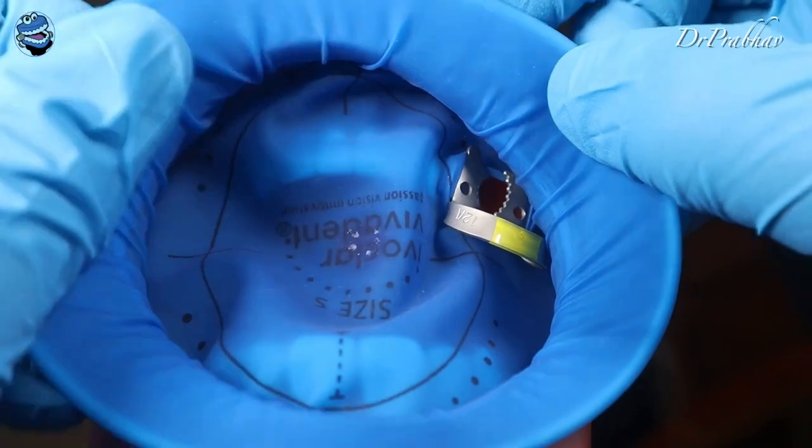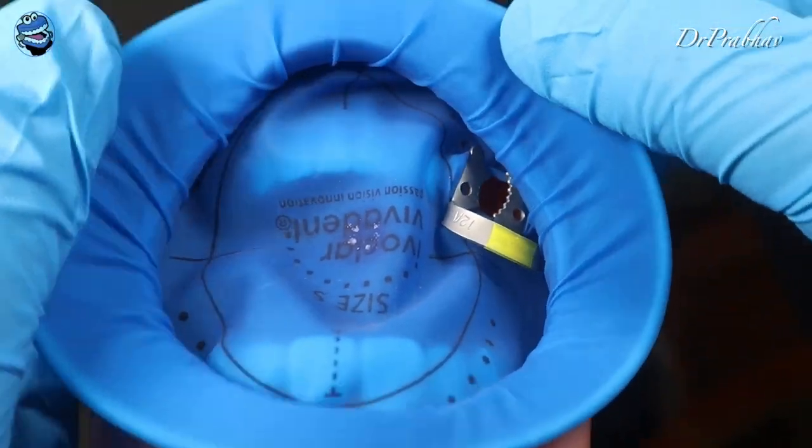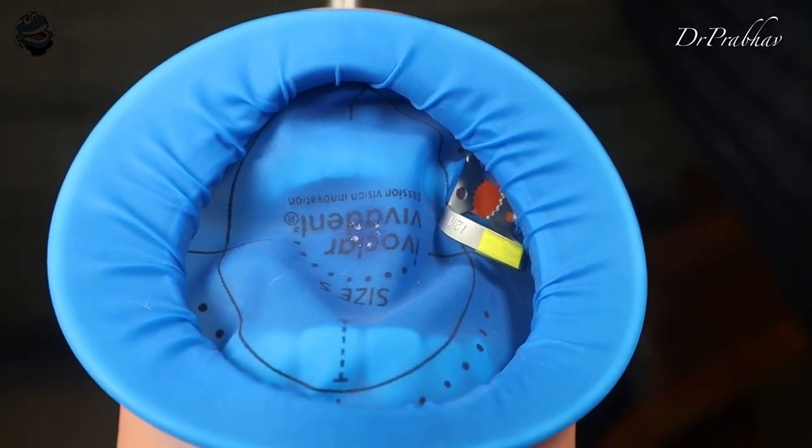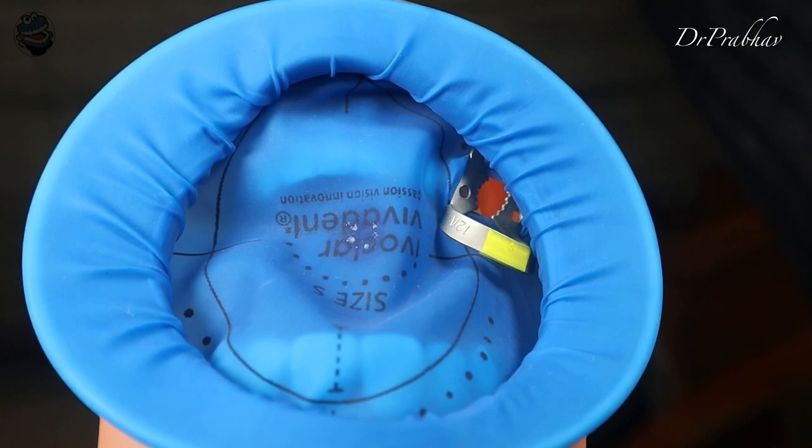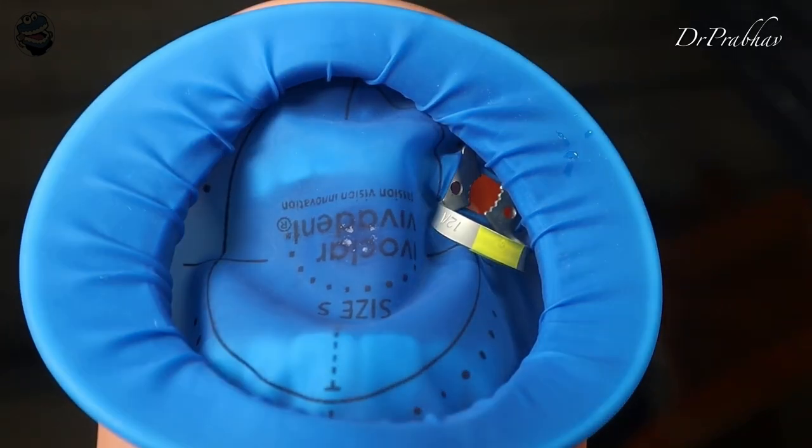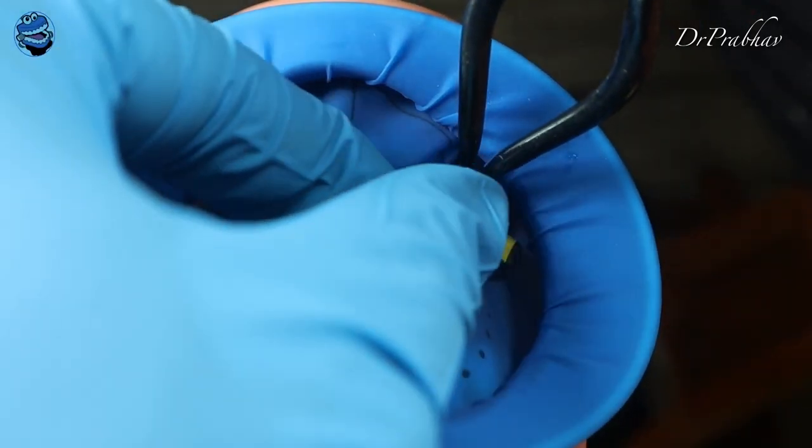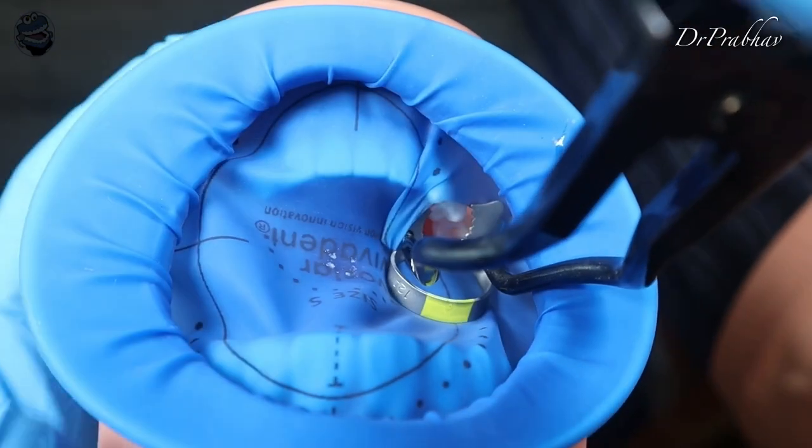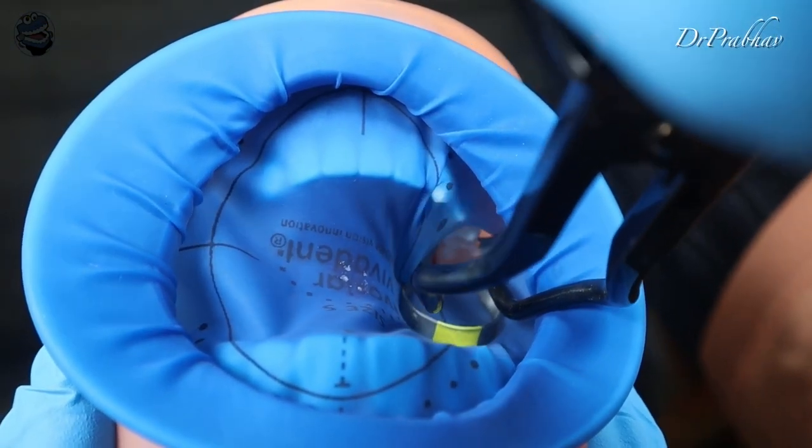Our frame is completely set into the dummy patient and he is comfortable. He is not crying, he is not doing anything. Now what we can do is we just need to place that clamp on the tooth that we desire to operate. So what we will do is we will hold the holes on these clamps with the help of clamp holding forceps, engage it, and now we will place it on the molar tooth for which we had punched the hole.